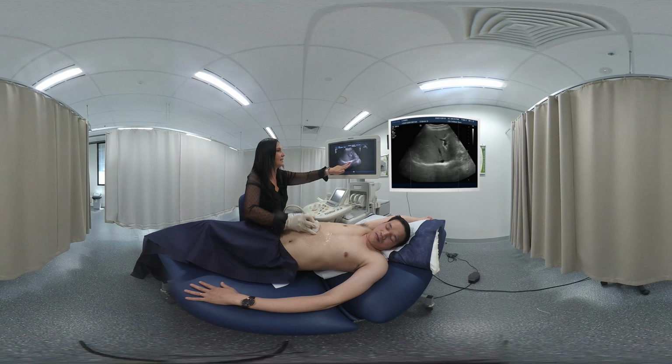So we're getting up there all the way through, just panning through, having a look, and breathe away, patient. So we're just going to do one more sweep. Big breath in. So remember, you won't be scanning like this in scanning skills. You need to do a lower focal zone, you need to do a higher focal zone. We're just having a basic look for our VR study today. So we're having a look through that liver in a longitudinal lie.